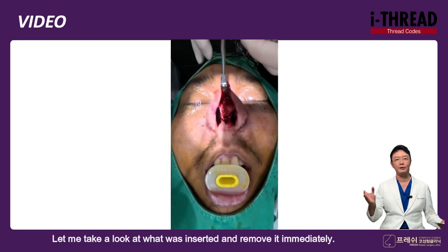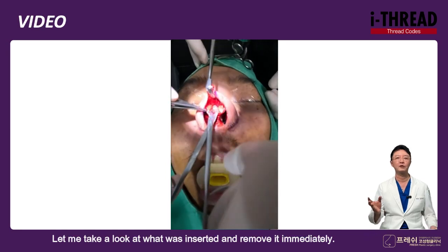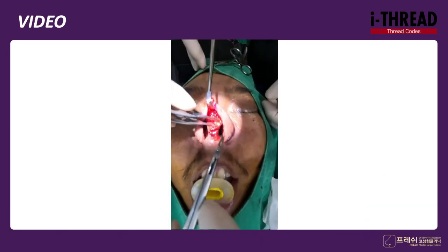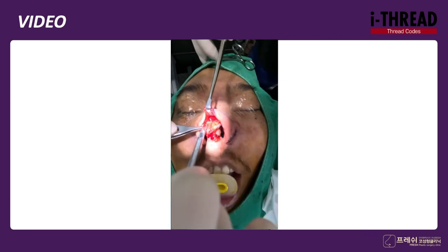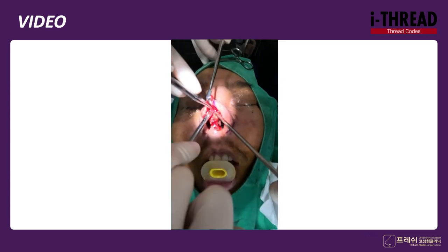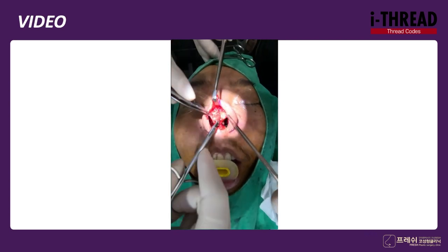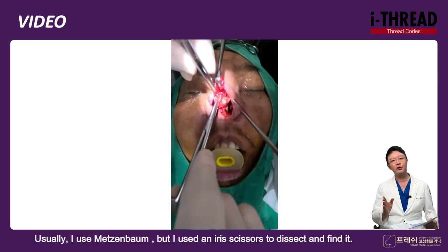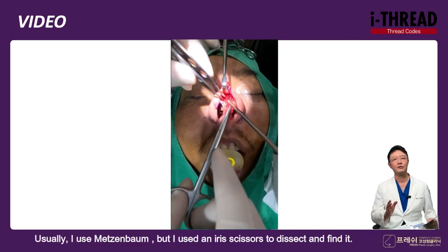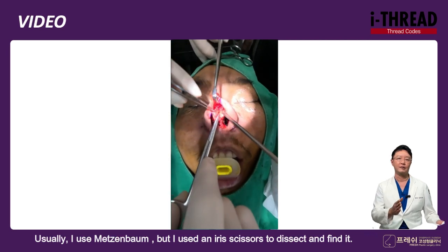Let me take a look at what was inserted and remove it immediately. As you can see, usually I use Metzenbaum, but I used an iris scissors to dissect and find it.